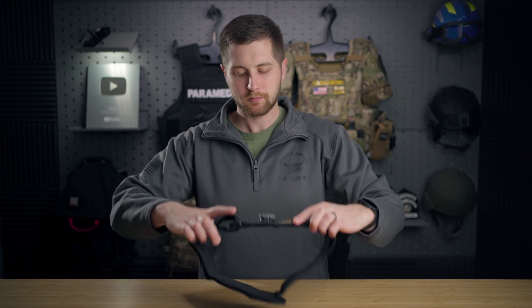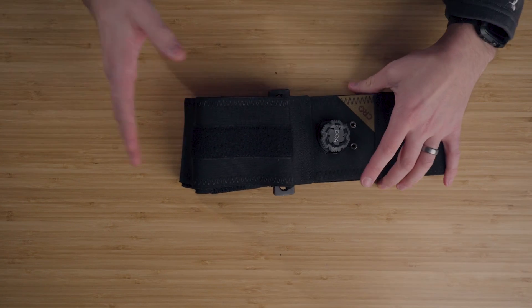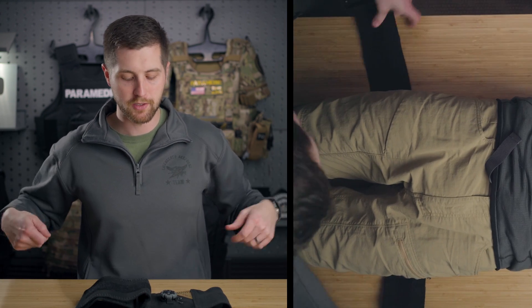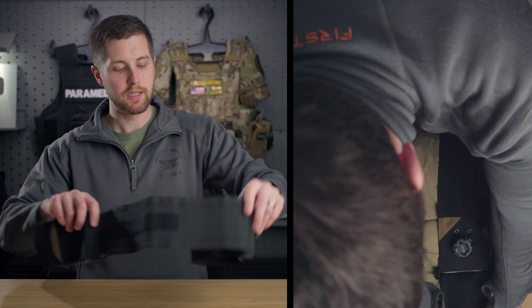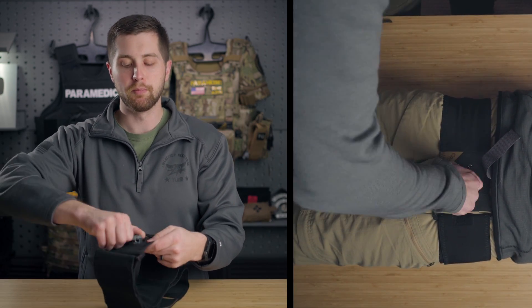The use of this is really simple, and for somebody that's not really familiar with pelvic binding, the way this is used is: if you have somebody with a significant mechanism of injury, you take this, you jimmy it up their legs, you put it over their greater trochanter, you tighten it down as much as you can with this band here. This comes over and comes out really easily — you tighten that down as much as you can, and then you tighten with the BOA band.